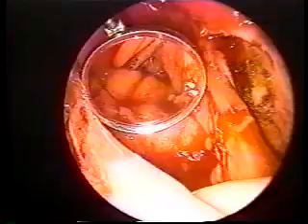Shown here will be the surgeon's view of a partial adenoidectomy performed with a microresector in real time. Tonsillectomy has already been performed, and the large obstructing adenoid pad is visualized. The shaver blade is positioned at the superior extent of the adenoid tissue and activated. The window is positioned over the tissue to be removed.